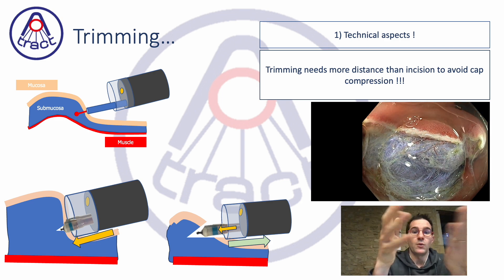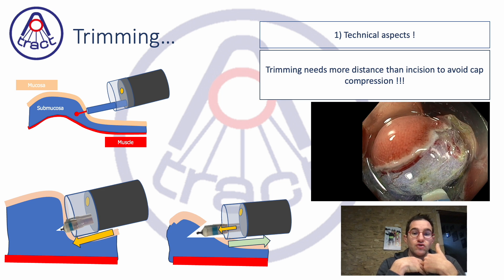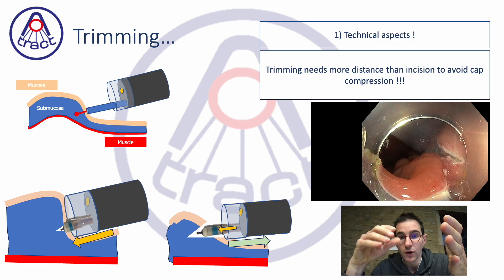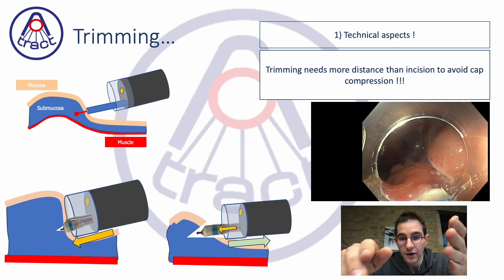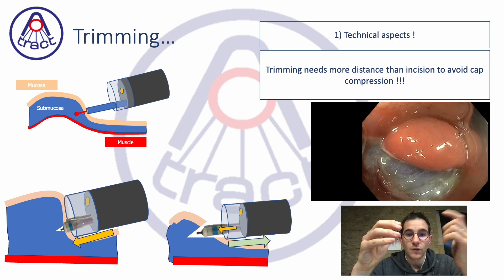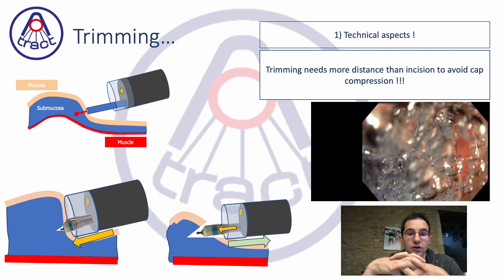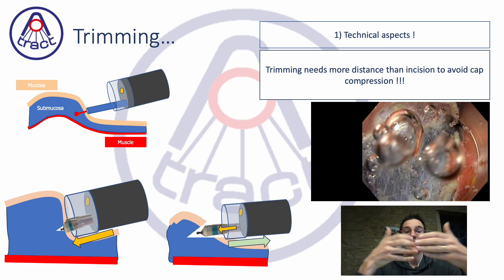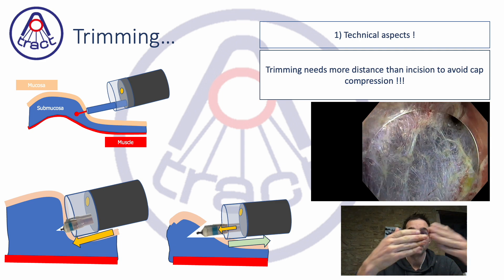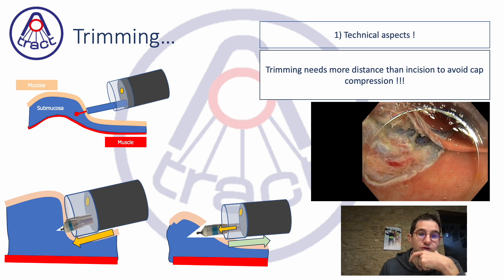Once you can get under, it becomes easier. But when the space is not sufficiently open, you have to take a little more distance in order to open correctly and do your trimming properly.